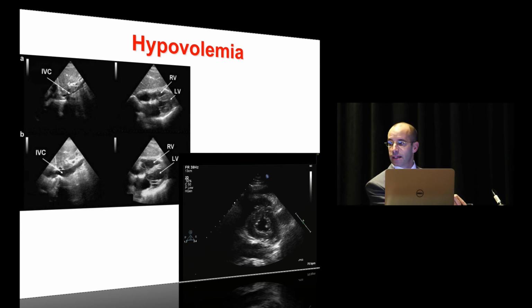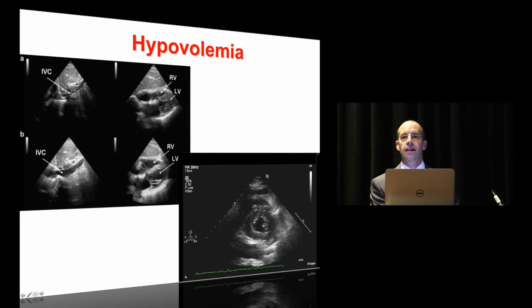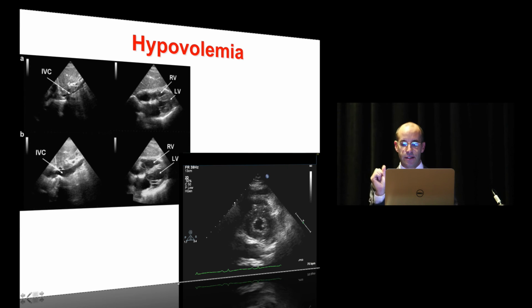So you would be seeing septal and anterolateral. You can see it's contracting all the way down, and it's what's so-called kissing ventricles. So it's completely underfilled. So sometimes with hyperdynamic, it may get close to kissing, but this is clearly not a hyperdynamic state, and this is someone who would need volume. Clearly, the heart is contracting well.